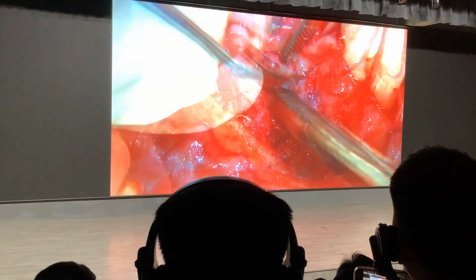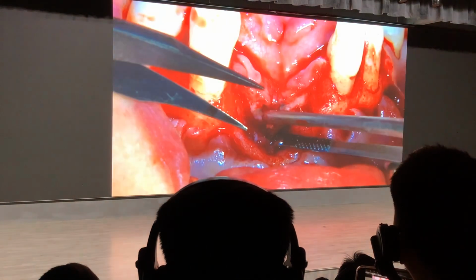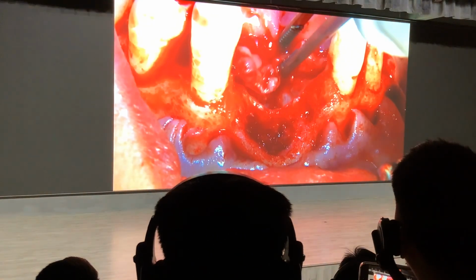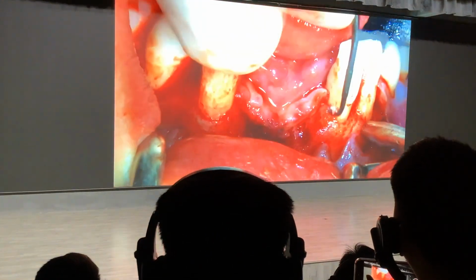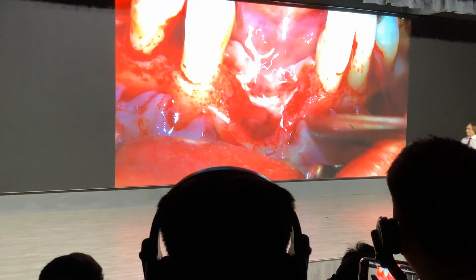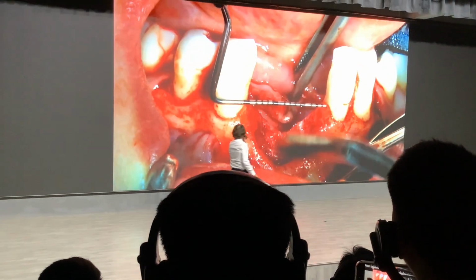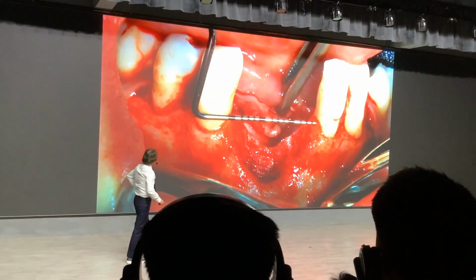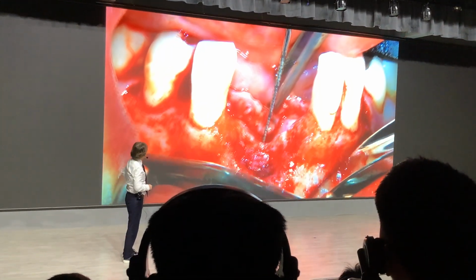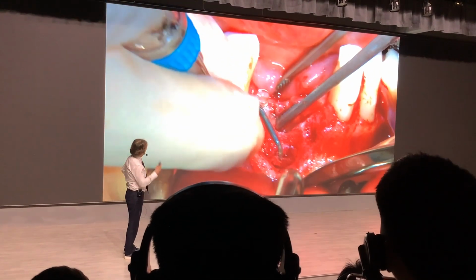It's moving a lot. Okay, let's take a look at the cleaning of the teeth, the lingual flap. Okay, that's going to be the most important. Look, watch now. Cleaning, a little bit more degranulation.